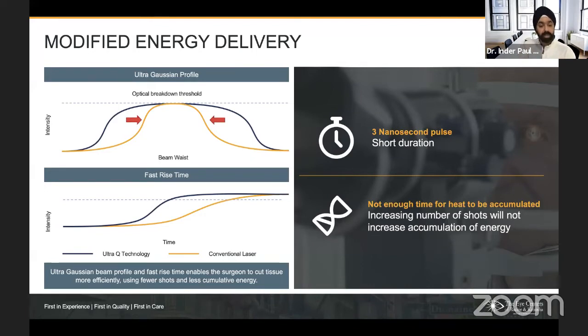Dr. Biswas, how about you? What do you stop at usually? Well, something similar. I don't go up to 400 to 500 shots. I limit myself to about 2000 millijoules total energy. Do you go by the number of shots or by the total energy delivered?